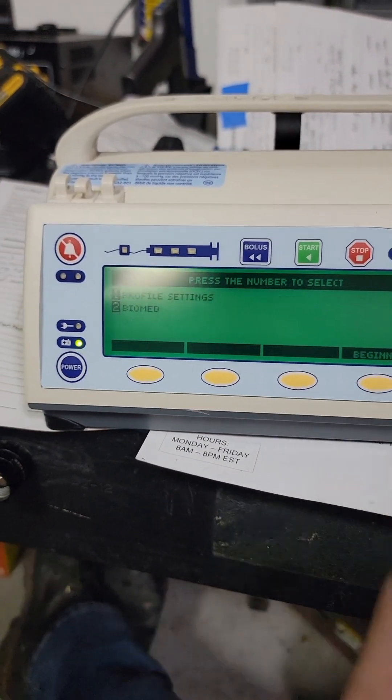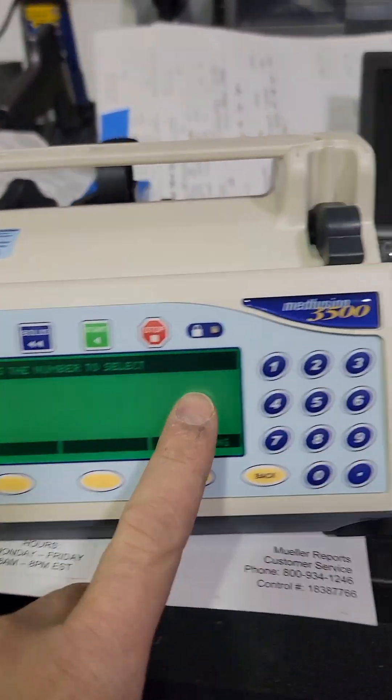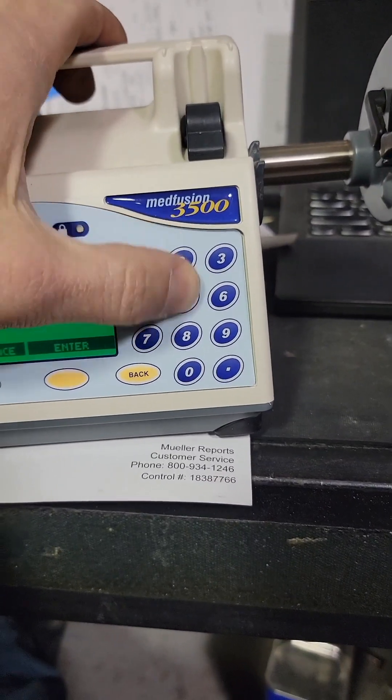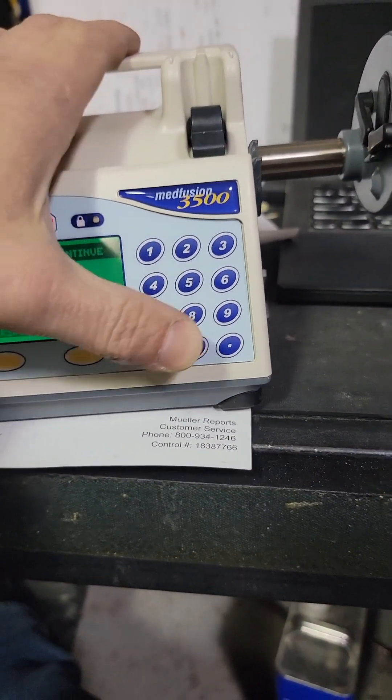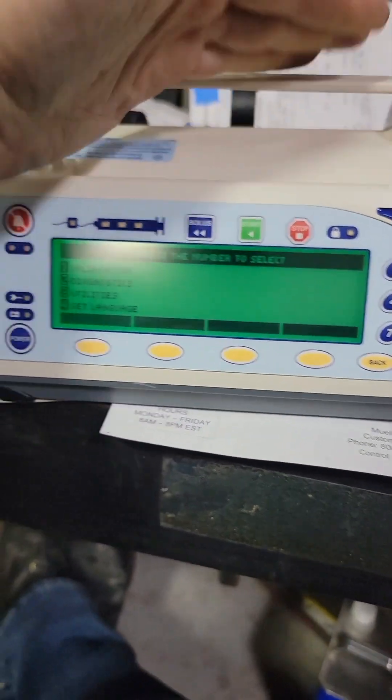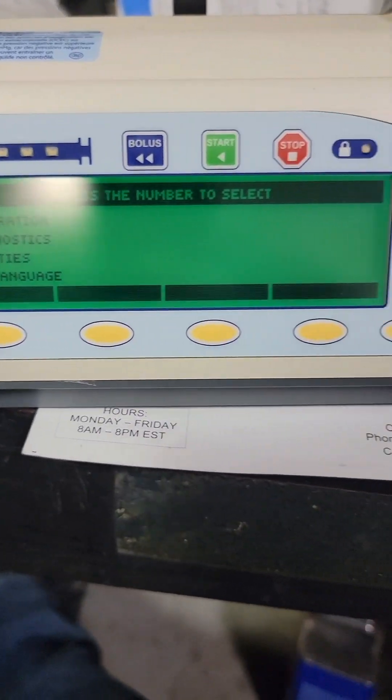There's all the user stuff. Hit more, choose biomed, 2, password — password's easy, it's right down the middle: 2, 5, 8, 0. Hit enter, and now we're in this screen.